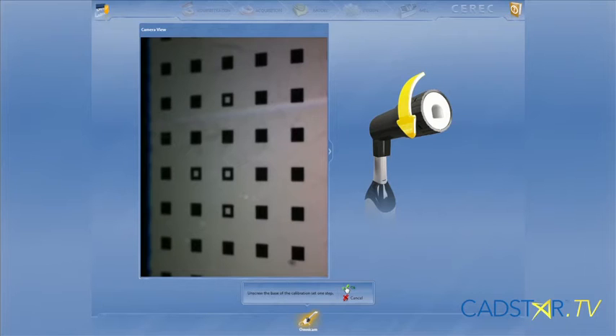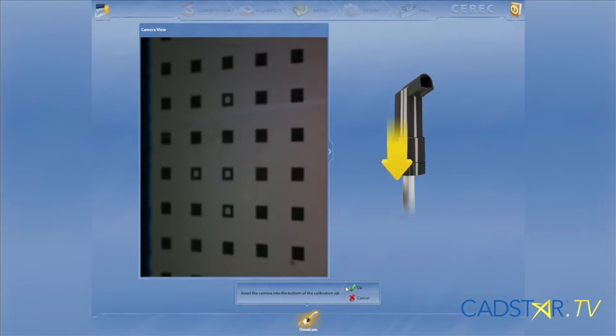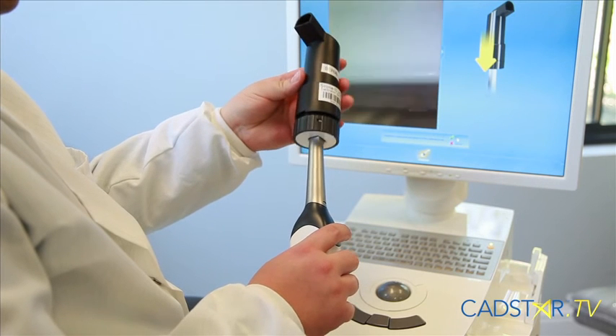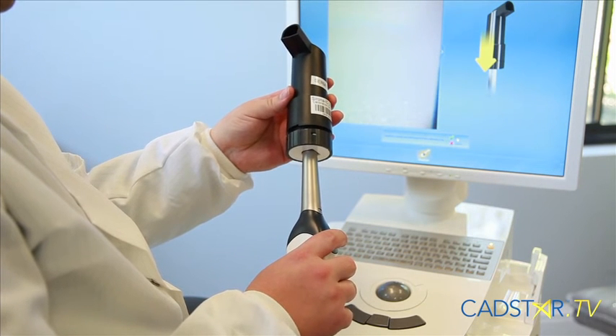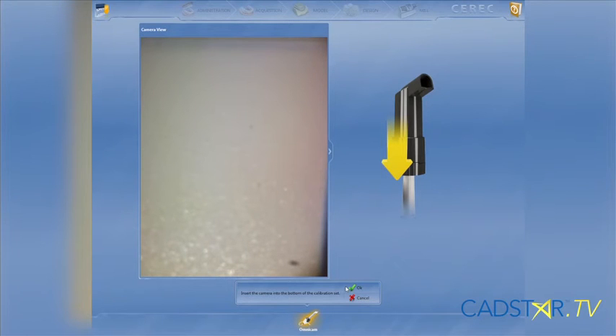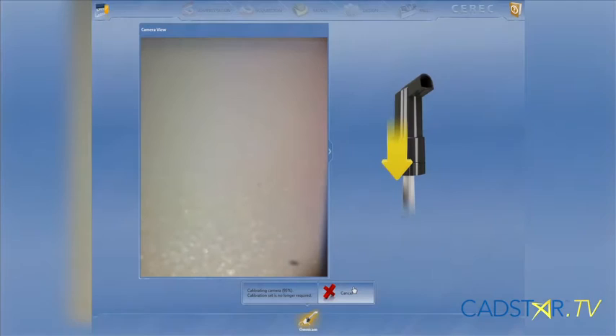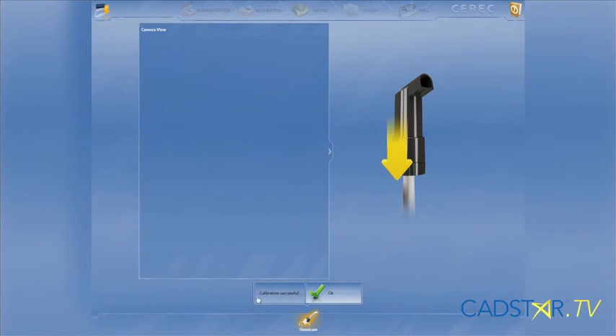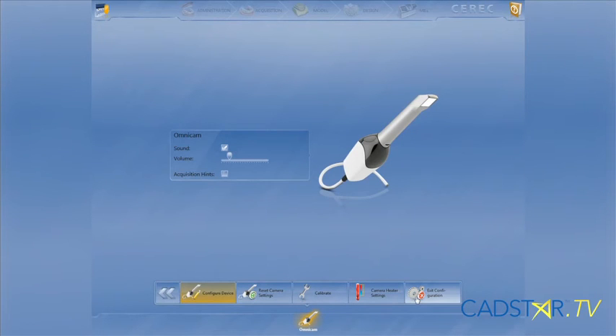The next step: when you see the arrow pointing to the other end of your calibration set, you'll take your Omnicam out and insert it into the white end. Insert it all the way down. Make sure you have a good grip so your Omnicam is not moving around, and then hit OK on the step menu. That will take a few more seconds. The software will notify you when you have properly completed calibration. Once you've completed, hit OK and you can go back to your desktop start screen.